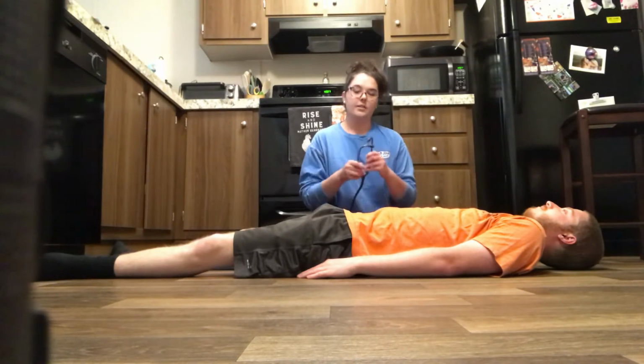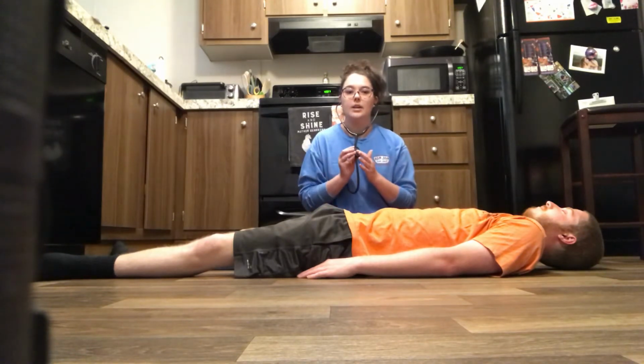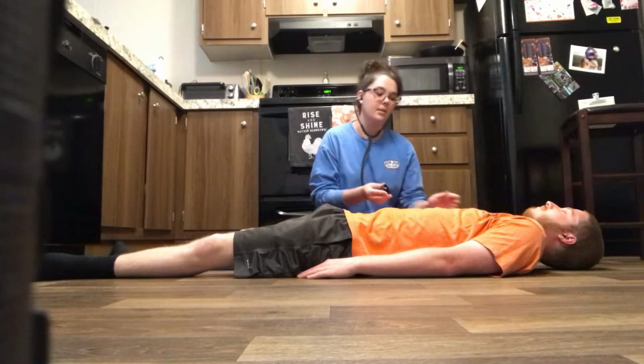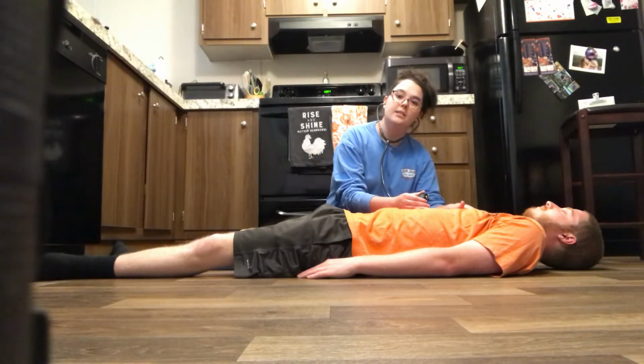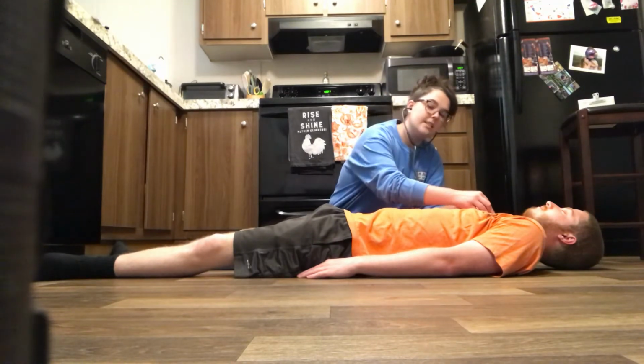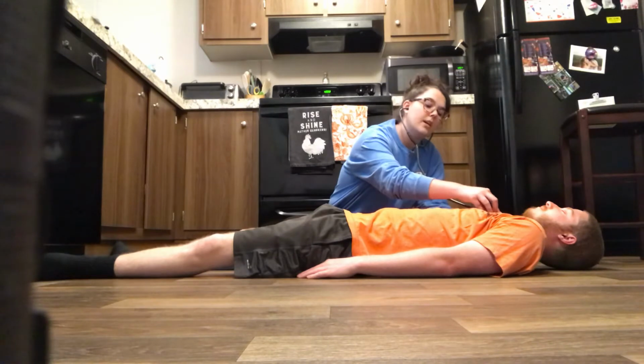So the first thing we're going to do is listen with the diaphragm of our stethoscope. We're going to go to the second intercostal space on the right sternal border, and that's listening to the aortic valve. The next one is going to be the second intercostal space of the left sternal border, and that's listening to the pulmonic valve.